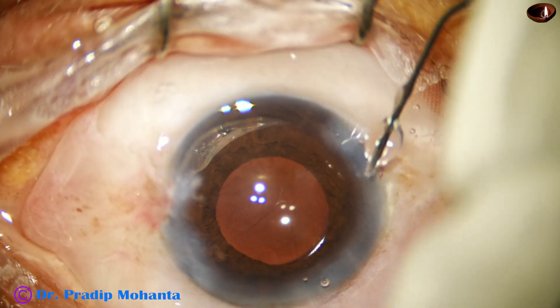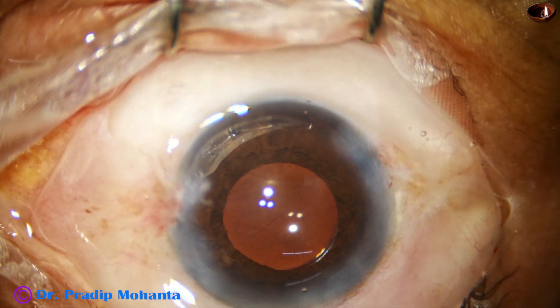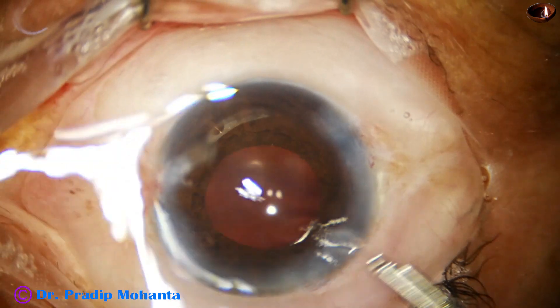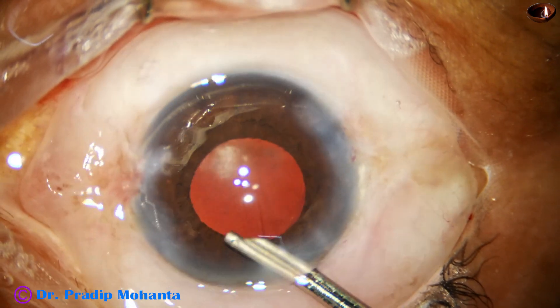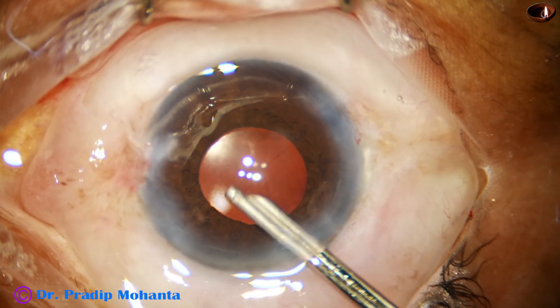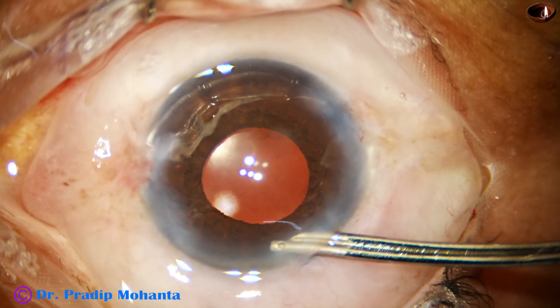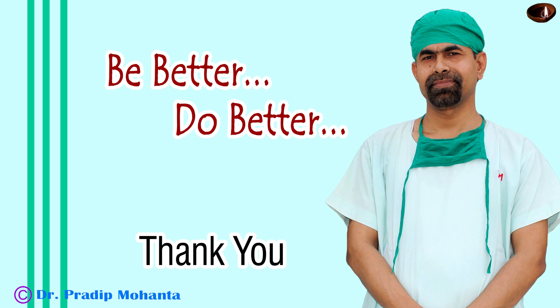From this surgery, what I want to tell you is that we have to have patience — patience and more patience when the surgery is tough — and we have to divide the surgery into small, easy steps. Thank you very much for your attention. Hope this video will help you in developing your surgical skills and make you calm and composed in a difficult situation.